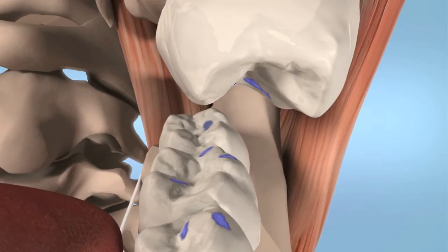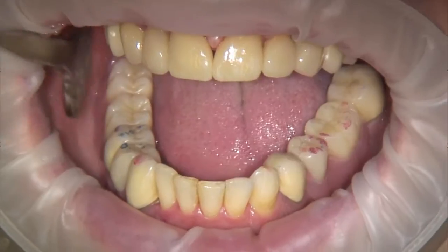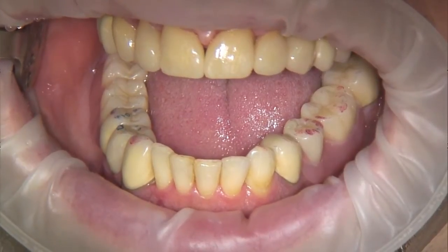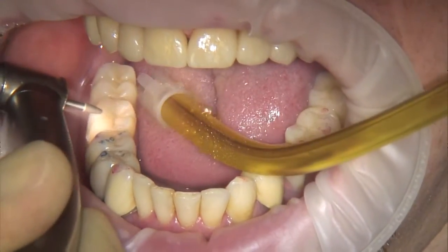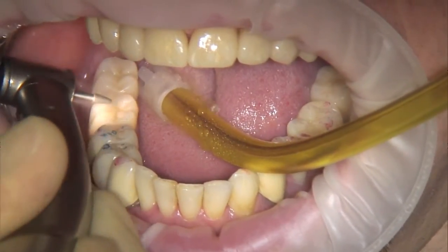Because of the sponge-like structure of this smooth blotting paper, the colour pigments and transculase bonding agent are squeezed out under pressure. More intensely marked spots, meaning strong pressure, indicate that more colour is squeezed out. But normal spots, with light or normal pressure, correspond to a lighter colour.